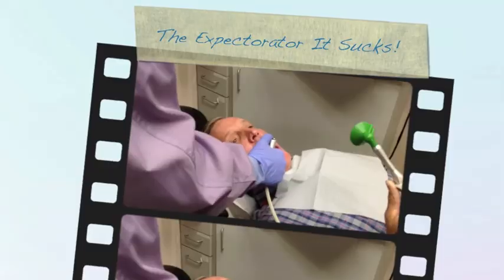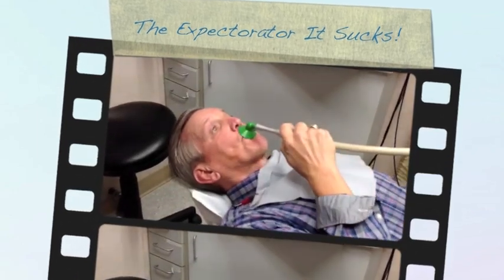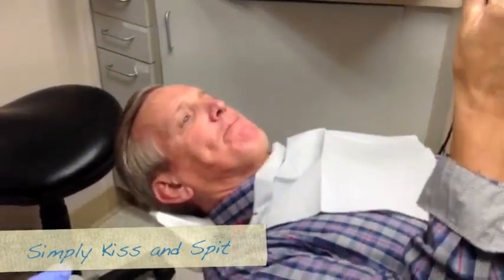I think this product really sucks. Well, this is really incredible. Let me try that again. You know what I like about this thing? It clears everything out — yeah, it's much more efficient. This product really sucks. Yeah, I never did like that soda straw thing; it felt like I could suck too hard. On this product, it really does suck — wow, does it really suck.